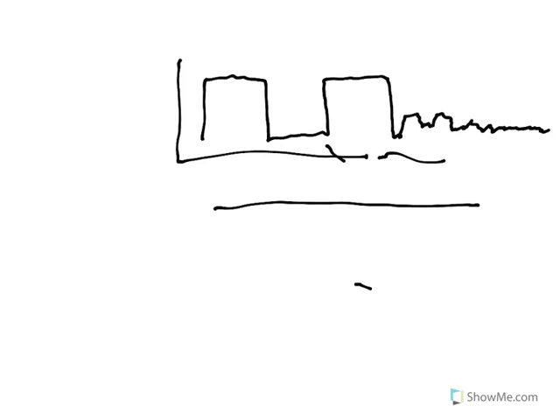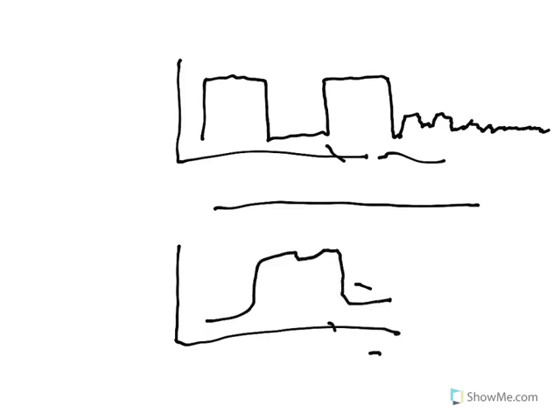It's a lot easier for that tube to become displaced than sometimes we think, and you could be looking at a problem there, obviously. All right, so we talked about this one in class as well. A little notching could be as drastic as this. Could look any which way. But notching in the end-tidal CO2 like this, and this is your patient trying to breathe.